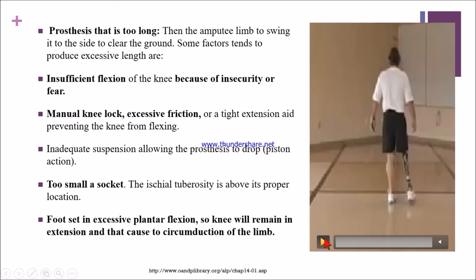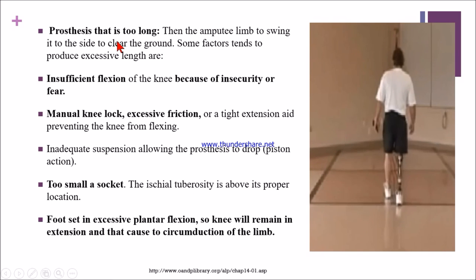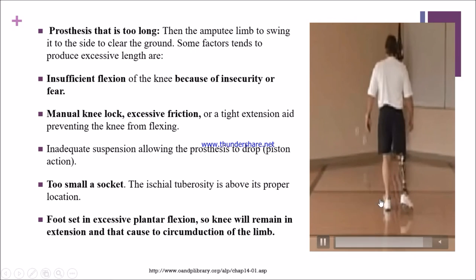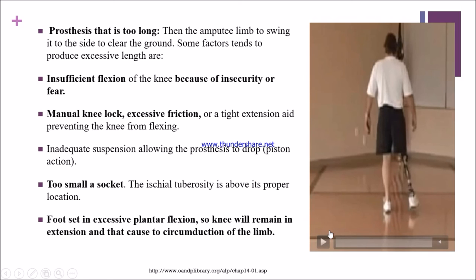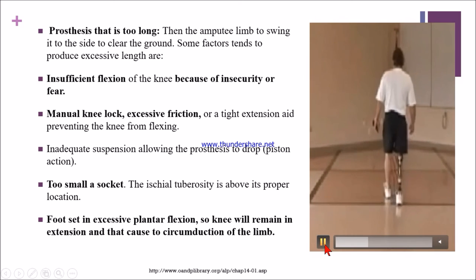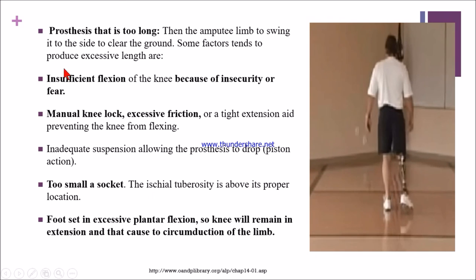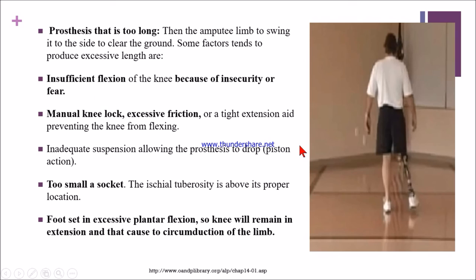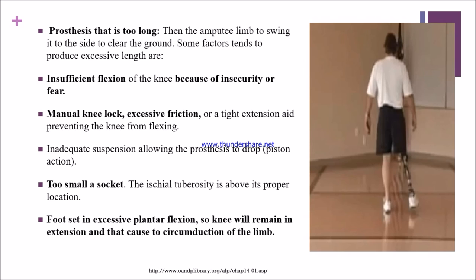In this video, we can see circumduction gait. If the prosthesis is too long, the amputee limb will swing to the side to clear the ground. Factors that produce excessive length include insufficient knee flexion — if the patient has insufficient knee flexion due to insecurity or fear of falling, they will circumduct their leg to clear the ground.